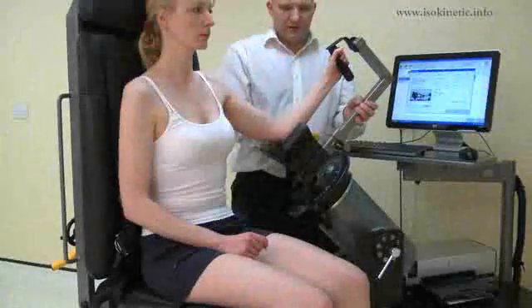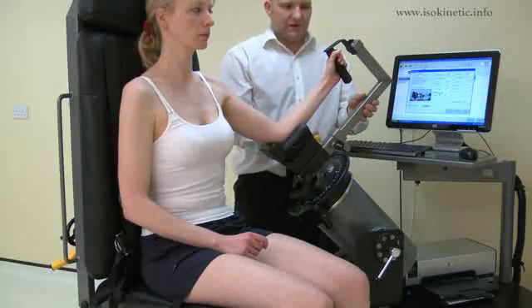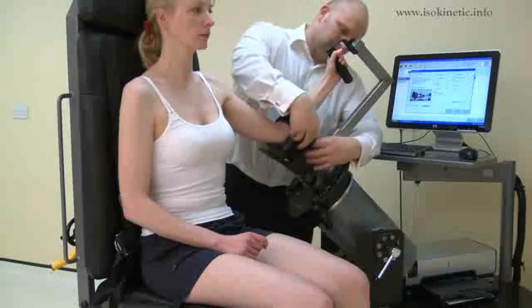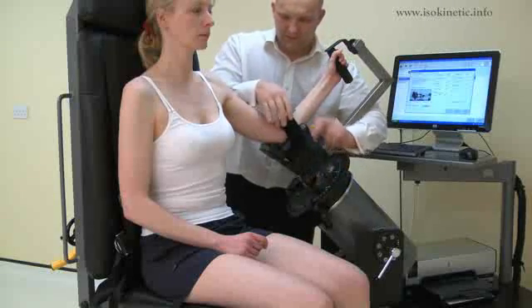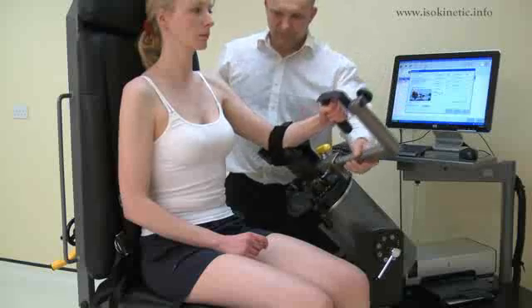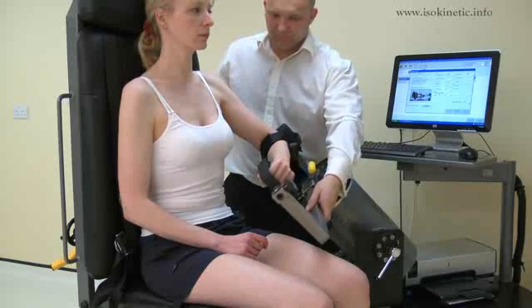Now position the hand grip. Loosen the screw and slide to a comfortable position for the subject. Secure using the screw. Before beginning the test, secure the forearm strap to hold the elbow into the stabilizer. Now check the axis of rotation.